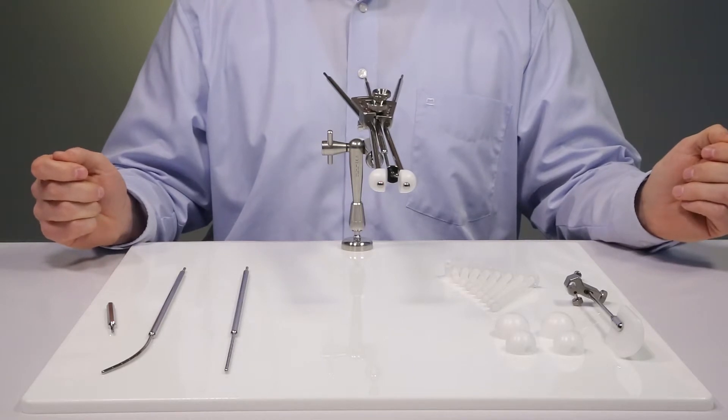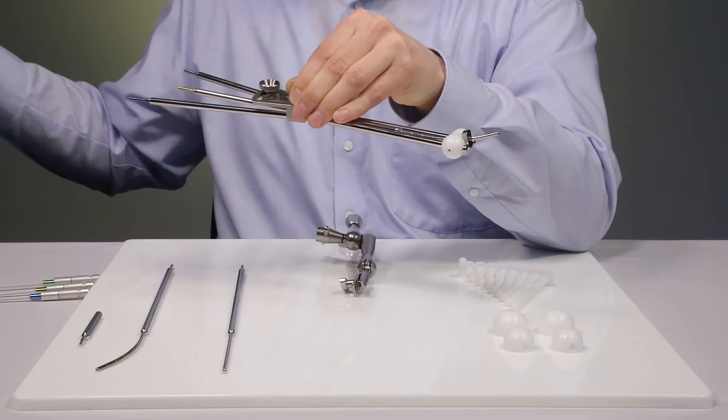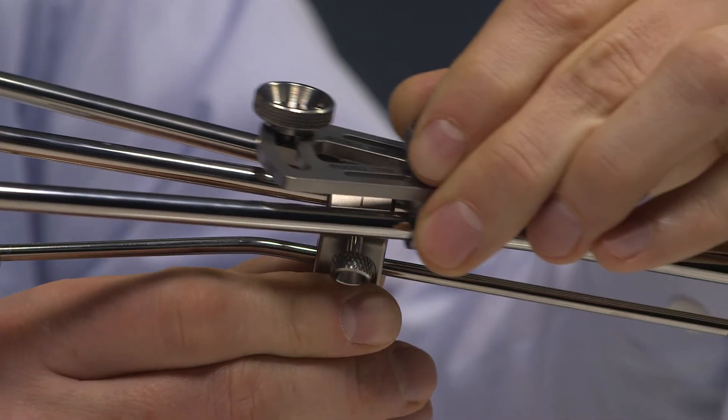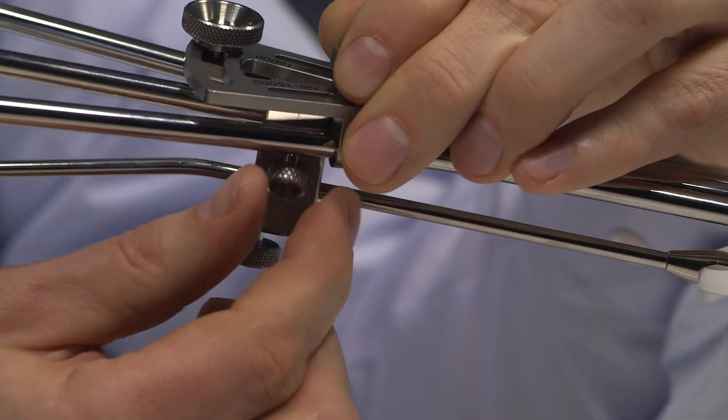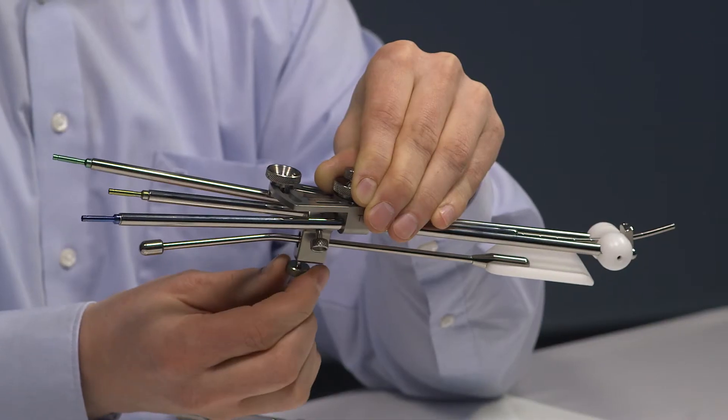Now the assembly is complete. In case the recto-retractor is used, it is simply guided over the I-O tube and fixed with the side screw. The lower screw can be used to adjust the angle.